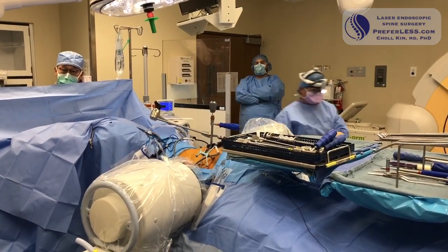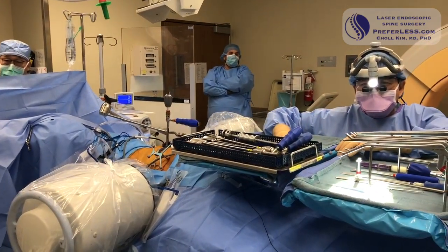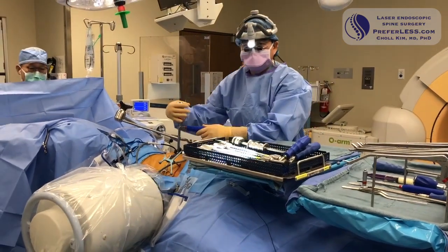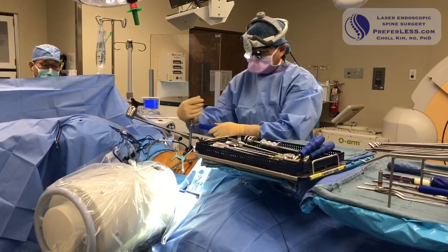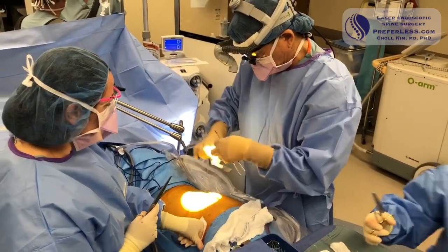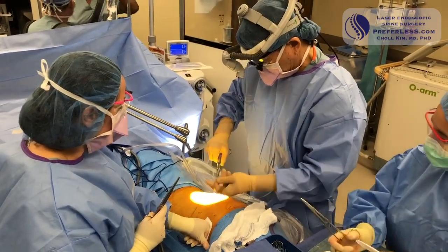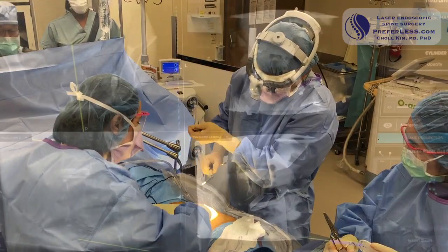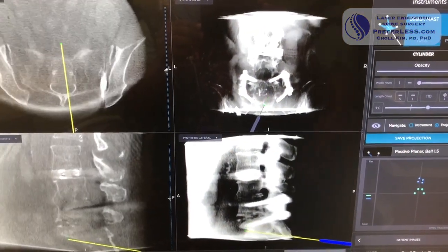This is when you can really see the end plate. Closing the 1-inch wound. I guess it's more like 1.5 inches. Suture says to Jen. It's in the sacroiliac joint, which is great because if I put in a pelvic screw, I won't have to remove that.